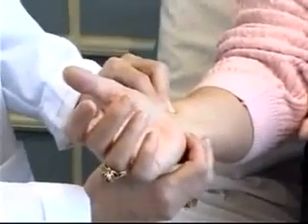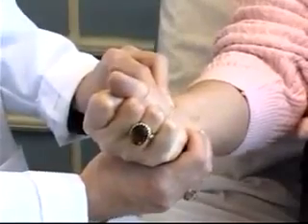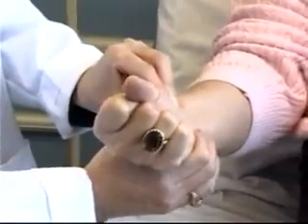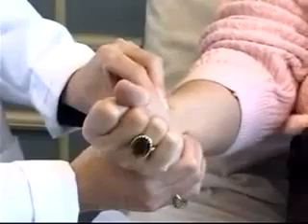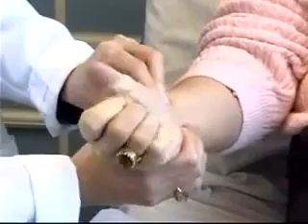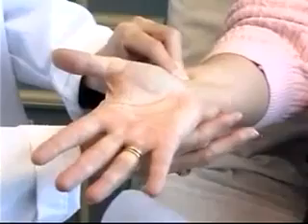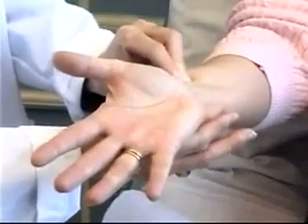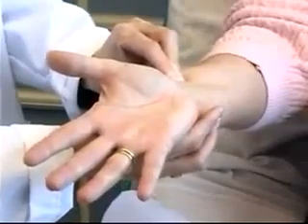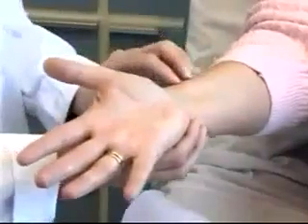I'm now going to ask my patient to please make a fist as tight as she can and maintain that position for approximately 10 seconds. I'm now going to occlude both the radial and the ulnar artery. After enough time has elapsed, I can ask my patient to please release her fist. I can release my grasp on the ulnar artery, and what I'm watching for is good flow returning to that hand. The hand pinks up again nicely. I now have a positive Allen's test, and I am okay to proceed with the procedure.